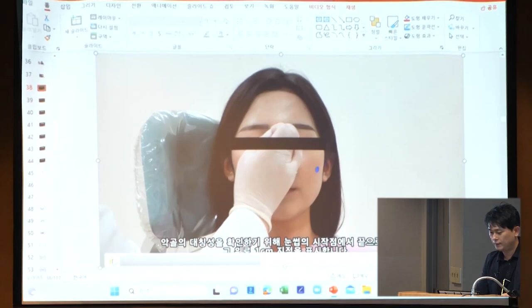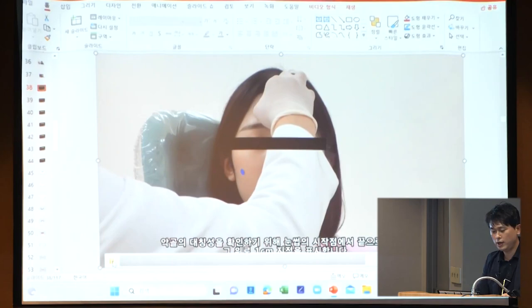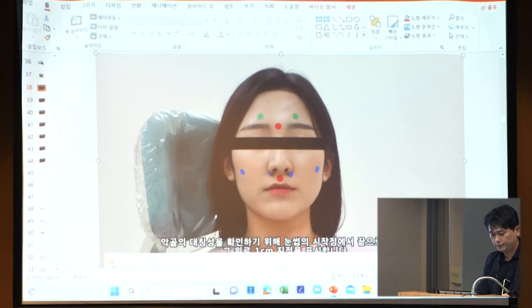This marker is for balance between right and left side. The green sticker indicates the balance of the left and right side. Why a left?